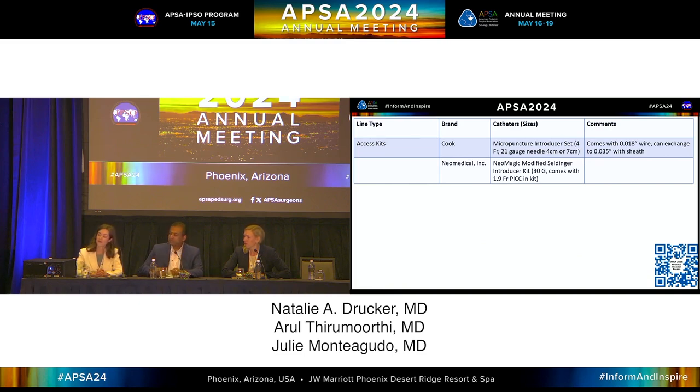A comment: for neonates, if you don't have the purpose-made intraosseous needles, an 18-gauge regular needle works and stands up quite firmly.